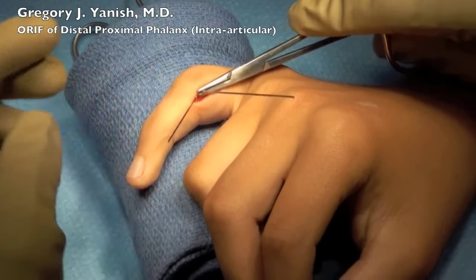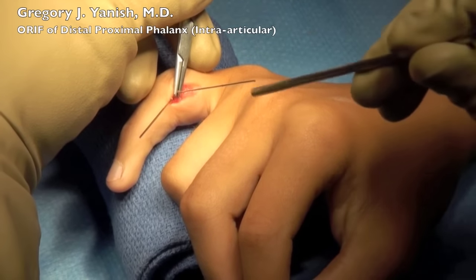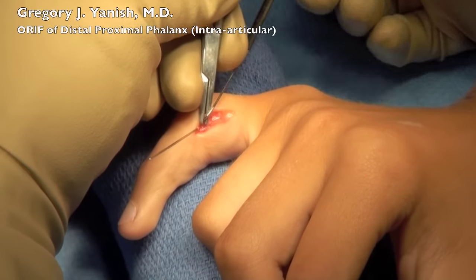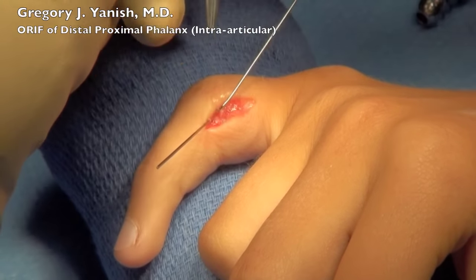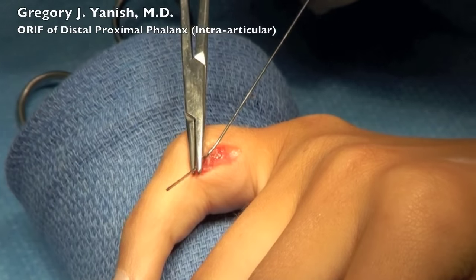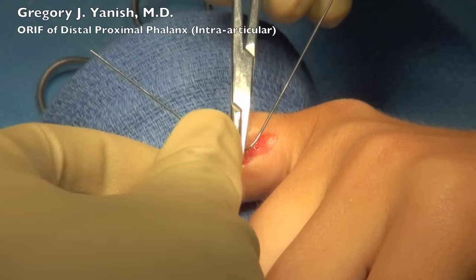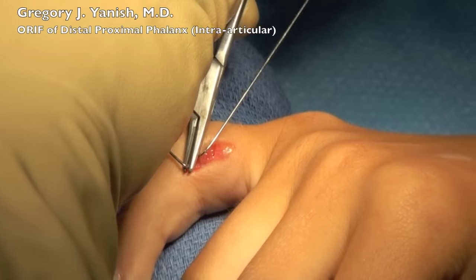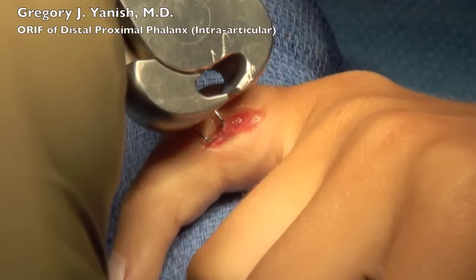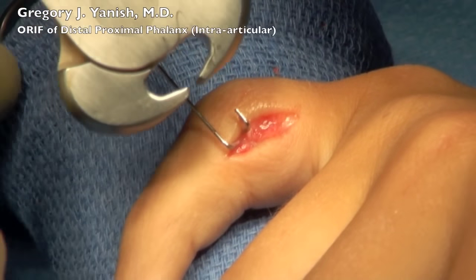Those are quite acceptable, and we're going to bend those over so that they don't poke the patient and lay nicely flat against the skin. This is done with a needle driver and a suction tip. The K-wires are then trimmed off with a wire cutter, and these will remain for one month.